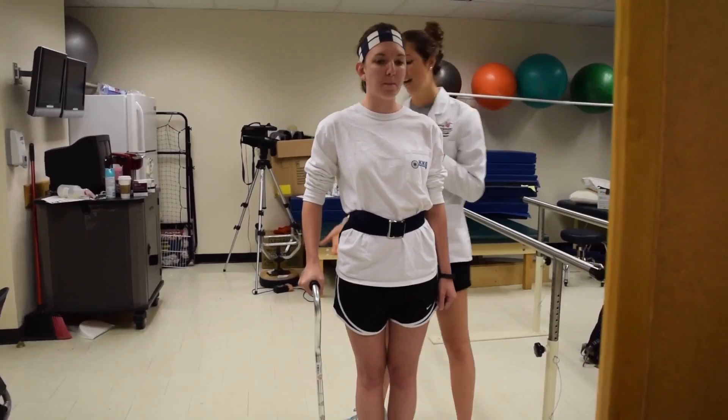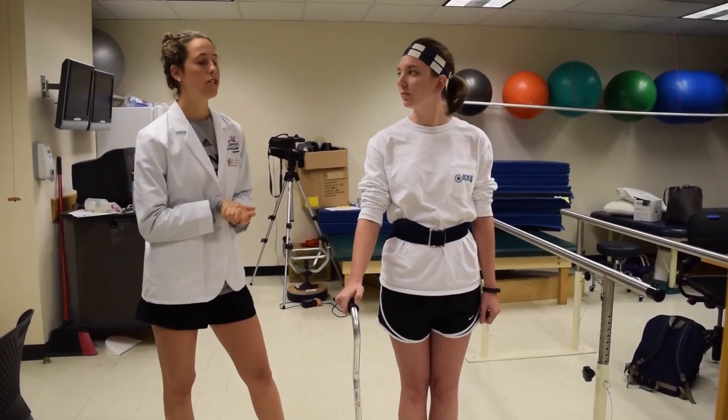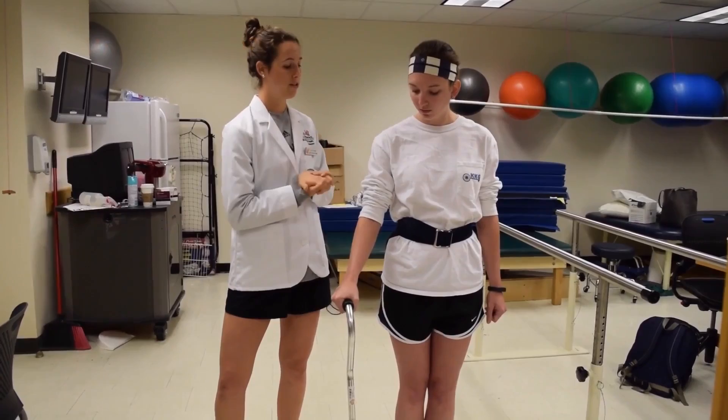The fit of the cane is similar to that of the parallel bars, but the fit is very important from the beginning — because if you start your patient off with the wrong fit, that's going to lead to some risks and problems down the road. Courtney, do you feel comfortable with what we learned today? Yes, I do. We are good to go. I will clean this equipment once our patient leaves and I will get ready for our next one.